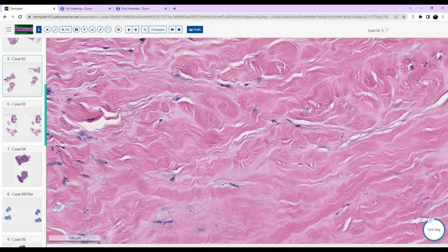So maybe this is more like sclerosis. Good. And what is your definition of sclerosis? Less fibroblasts. Okay. Anything else? Like lots of thickened, scarred-like looking collagen. Well, okay. Basically, we call that thickened, homogenized collagen bundles.